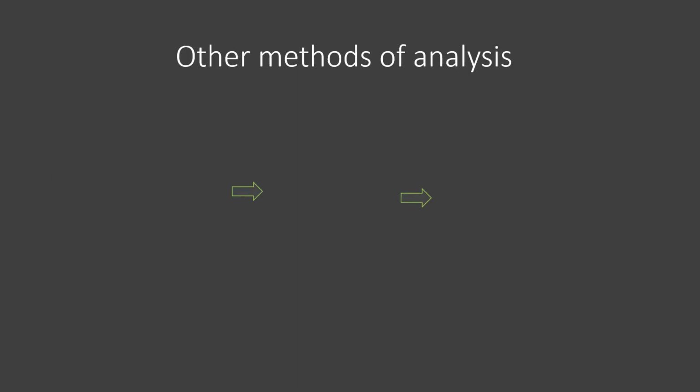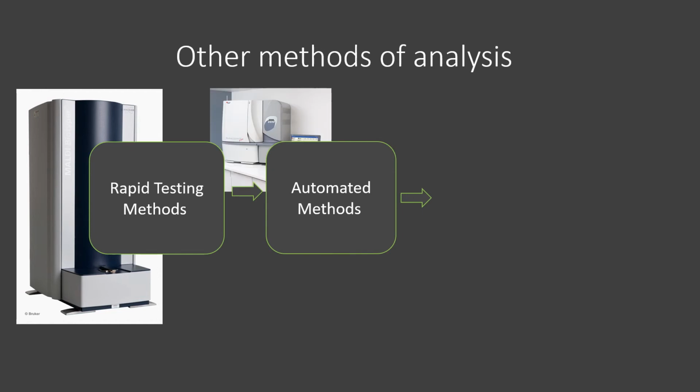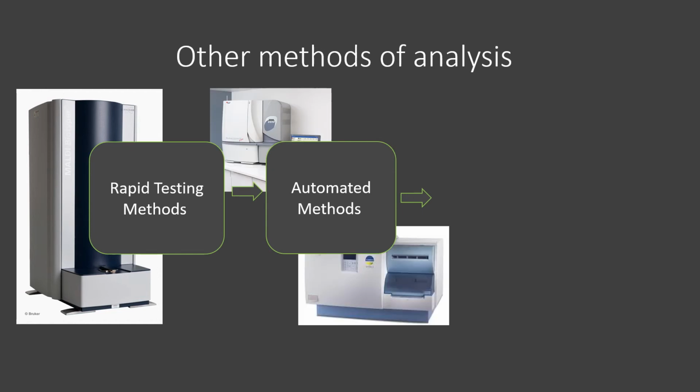Newer, more rapid methods of detection, such as MALDI-TOF MS, have been proposed. This method of testing is effective since it has the ability to test direct blood samples, so no time needs to be wasted on producing pure cultures. Automated methods, such as the MicroScan WalkAway 96 system produced by Dade Behring, or bioMérieux's VITEK 2 test, have also become options for clinical use. These methods do have a degree of inaccuracy, so they are best when coupled with conventional methods of analysis.